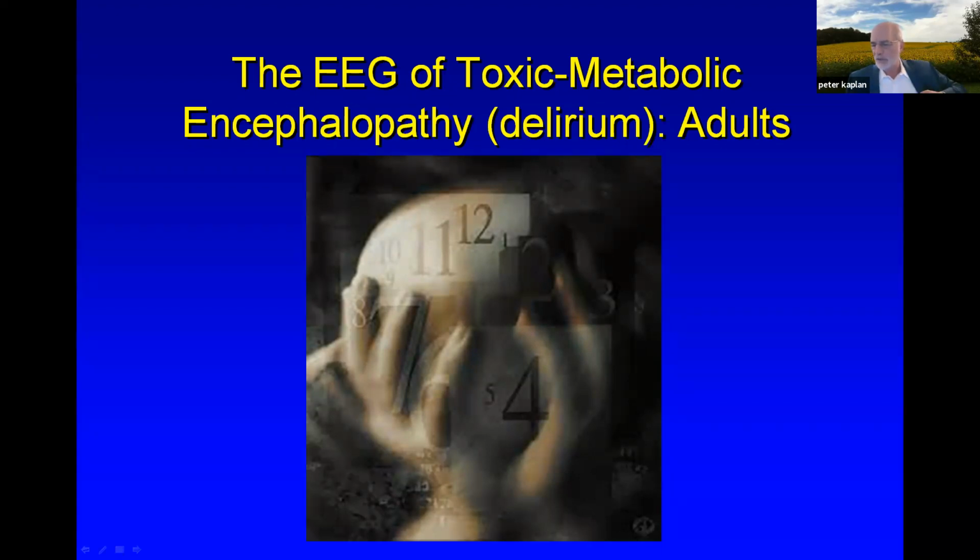Ictal is obvious if there's the clinical correlate of movement, which is a bit of a factitious finding, because there's no reason to believe that if you just happen to spare the motor cortex, but you have the same sort of insult to other areas, it isn't equally damaging. So efforts are being made, therefore, to determine when to intensively treat with anesthesia. And usually what we do is we fold in the cause and the level of consciousness into the EEG pattern to make a determination of how morbid we think it is.